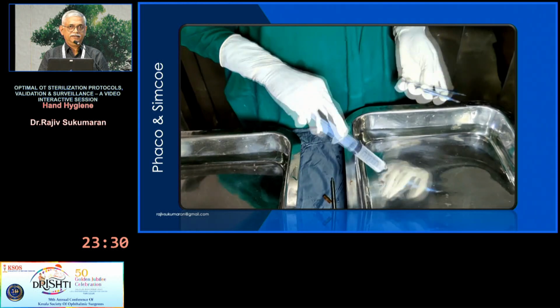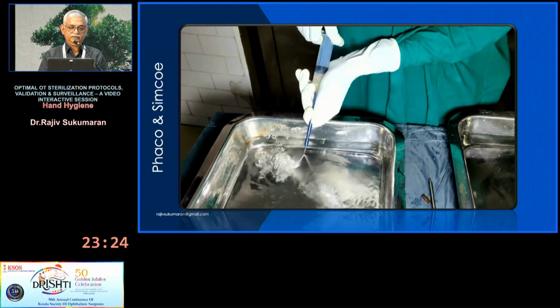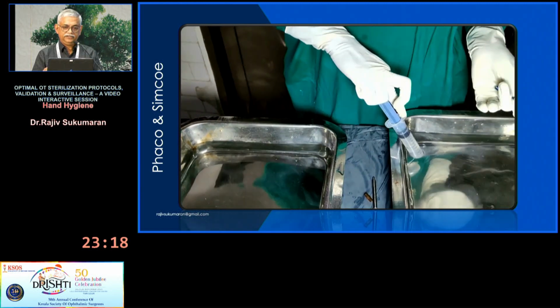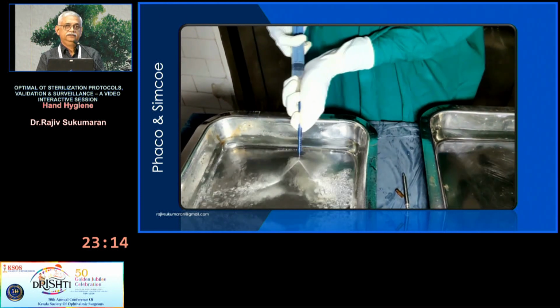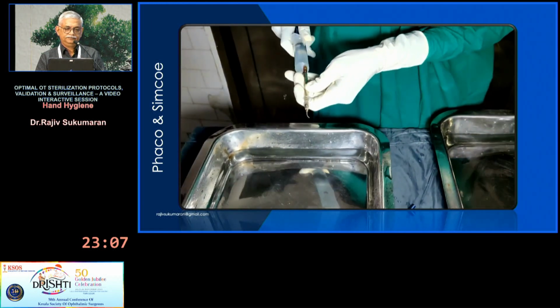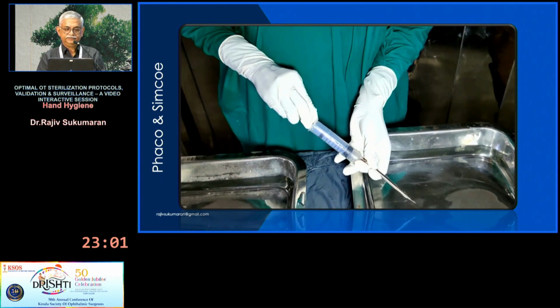The same thing applies to your irrigation aspiration cannula also. For aspiration, you aspirate the cannula instead of pushing. Normally we do this, which is actually wrong. You have to aspirate only.